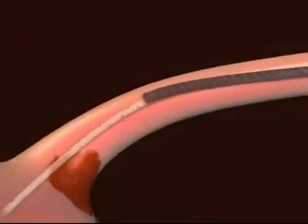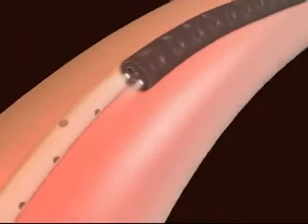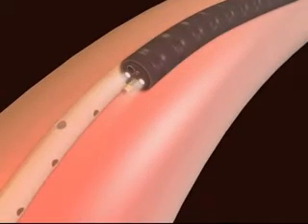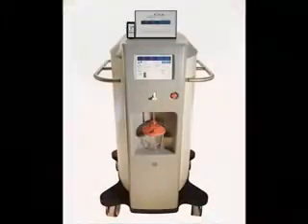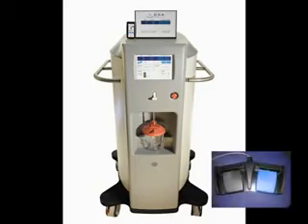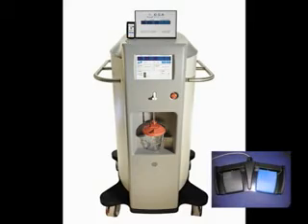Next, the 7 French 2.3 mm cryospray catheter is inserted through the working channel of the endoscope and advanced to the targeted treatment area. The physician activates the flow of cryogen by depressing a foot pedal attached to the CSA console. Liquid nitrogen exits the catheter at low pressure and begins to freeze the tissue upon contact.